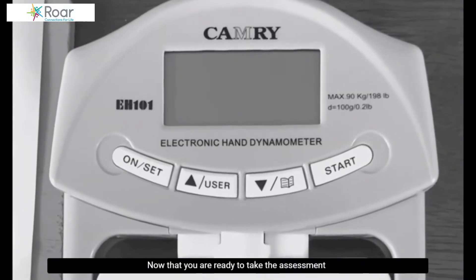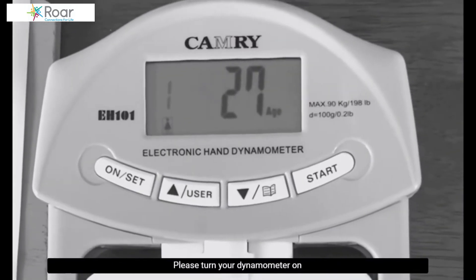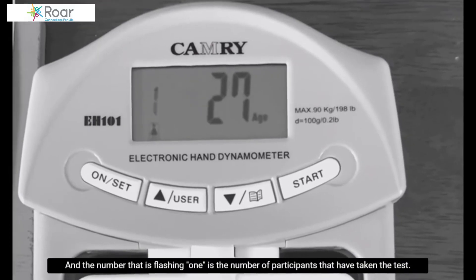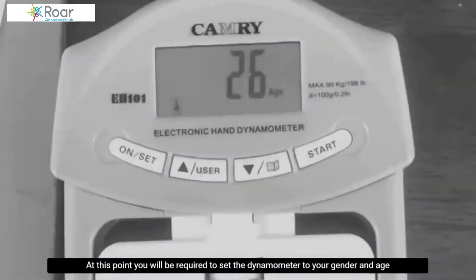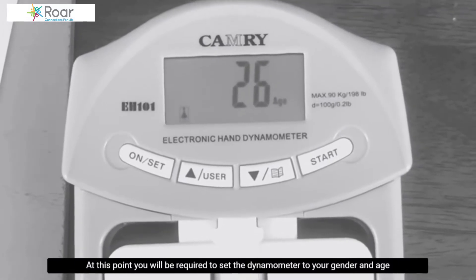Now that you are ready to take the assessment, please turn your dynamometer on. The number that is flashing is the number of participants that have taken the test. At this point, you will be required to set the dynamometer to your gender and age.